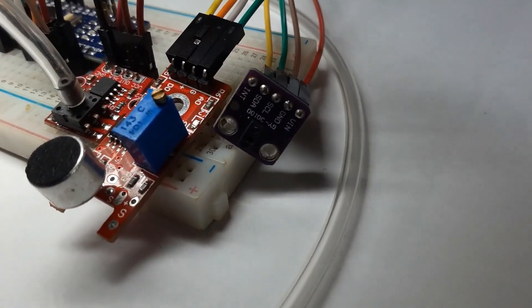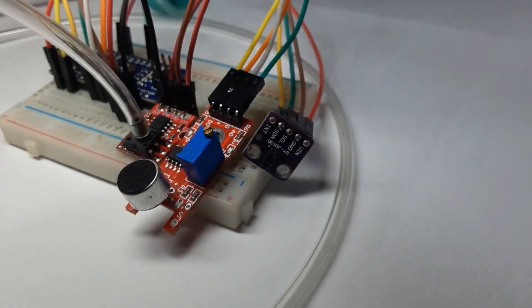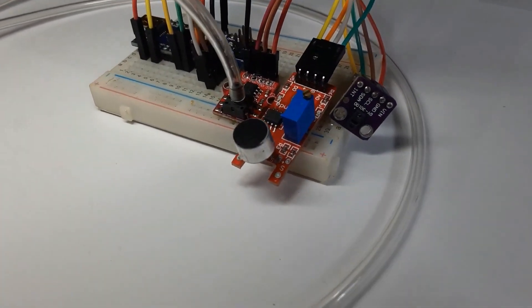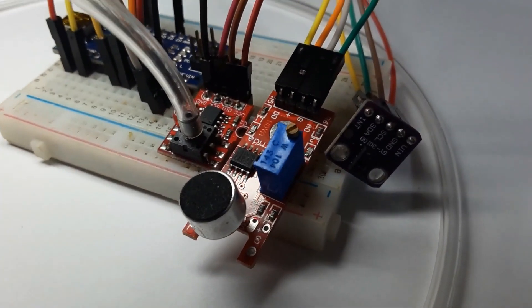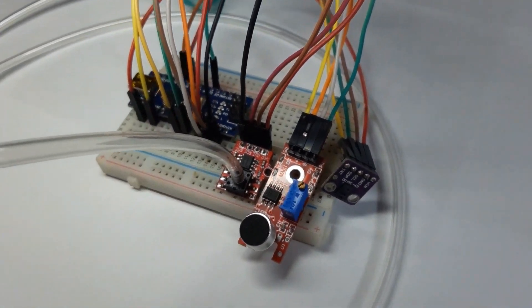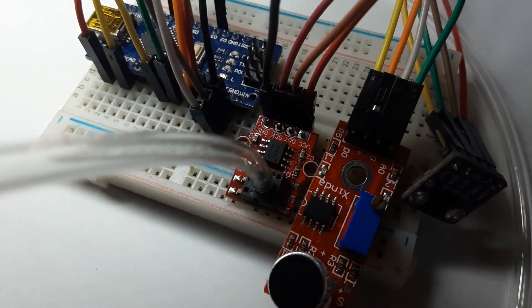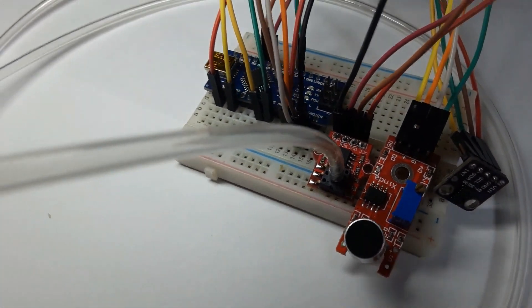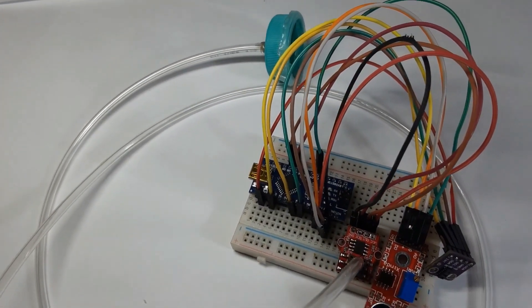We used several components to create the prototype, including an acoustic module sensor, an ESP Wi-Fi module, a pressure sensor, and heart rate and SpO2 sensors. All of these were integrated on a breadboard, but inside the pillow we tried to arrange them in separate parts so it can be more comfortable for the patient using the pillow.